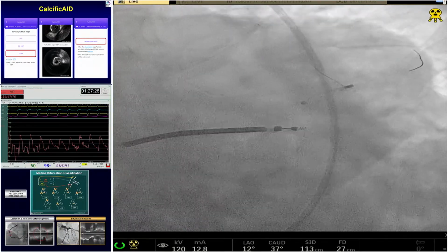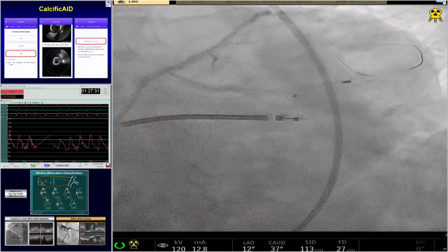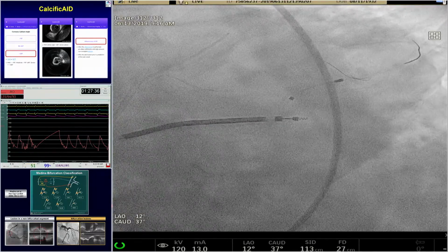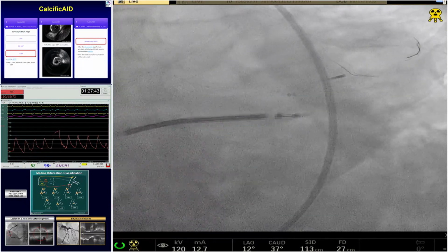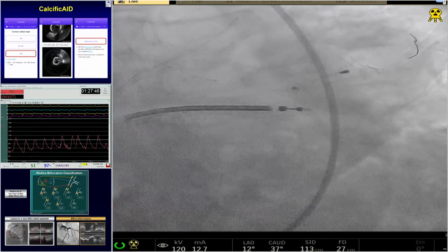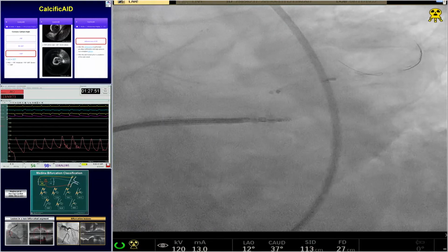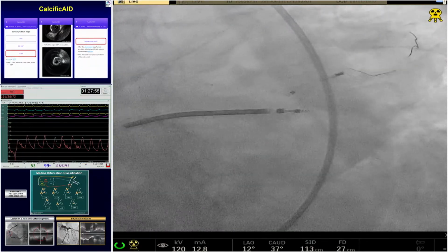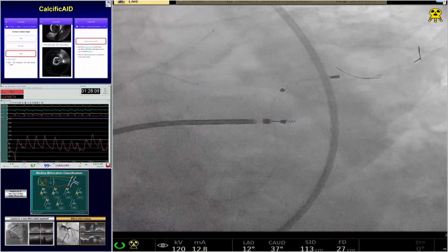So, okay, I think in all fairness, Dr. Kinney and Dr. Sharma, everyone here is thinking that the strategy for all bifurcation lesions should be provisional, and then, of course, feeling that with current technology, going to a 2-stent strategy is not an issue at all if needed. But here, I think you're thinking just go straight forward, not waste any time, and move forward because you really feel that this is, and you're very convinced by the DK crush data. Is that right, Dr. Sharma?